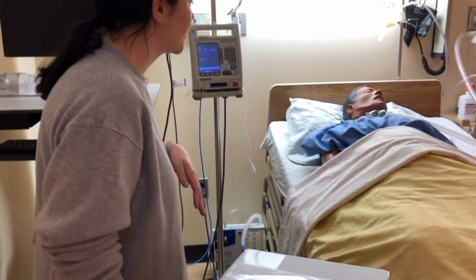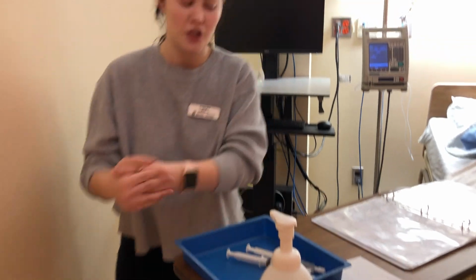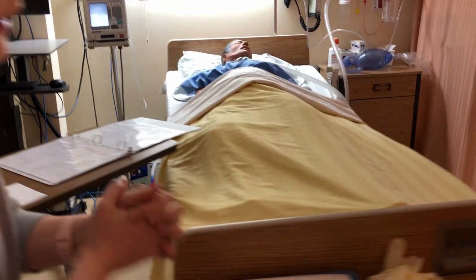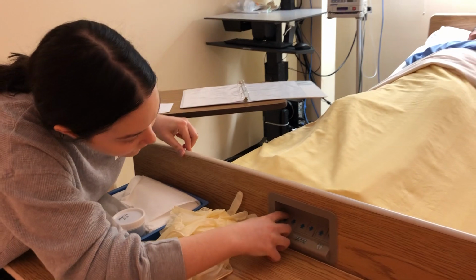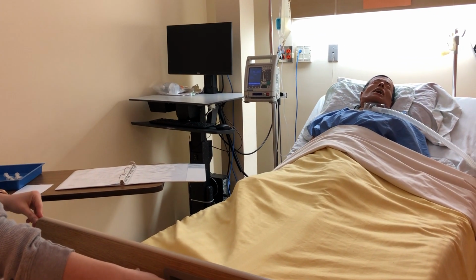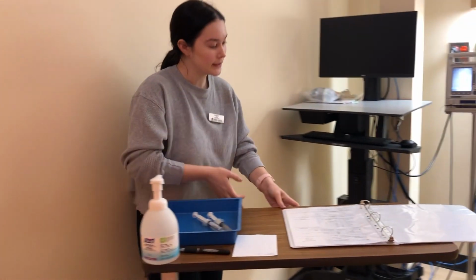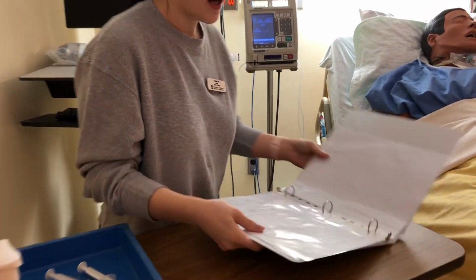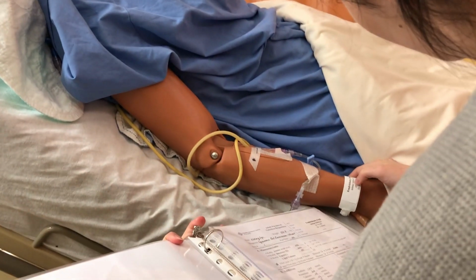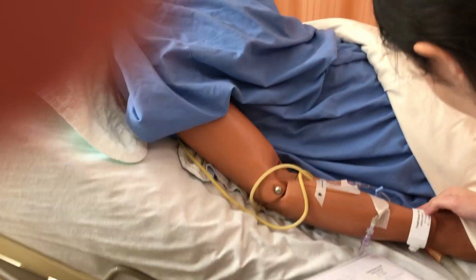I'm going to be your nurse, your student nurse taking care of you today. Just going to do some hand hygiene. I'm going to raise the head of the bed. And I'm coming in and I'm doing a check. I just want to make sure that I have the right patient. So I have Fredrickson, 0990127. Okay, so right patient.